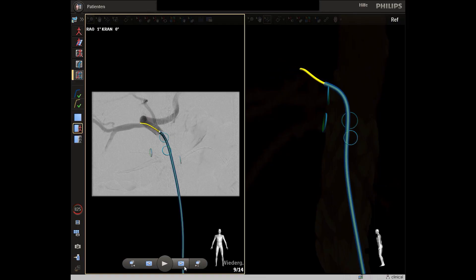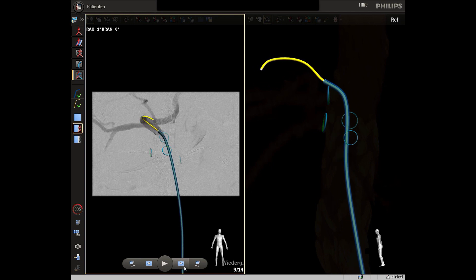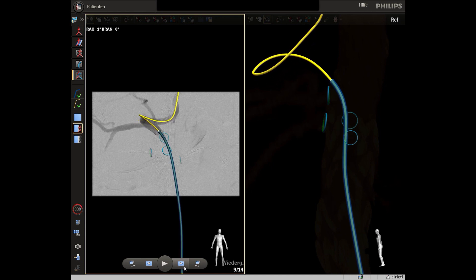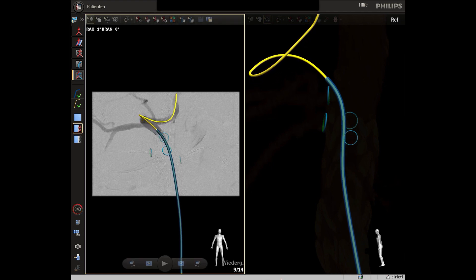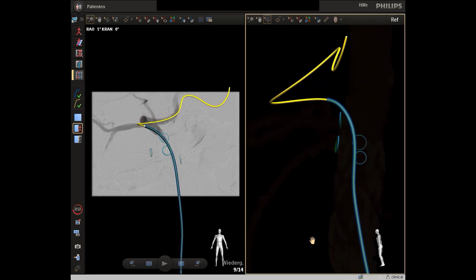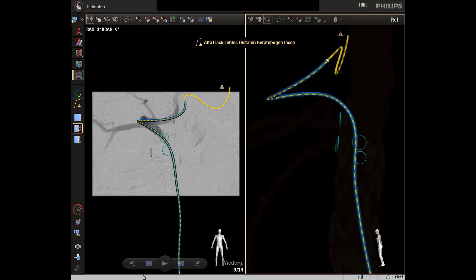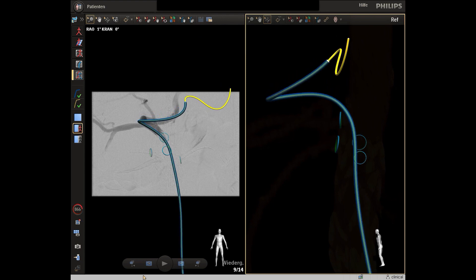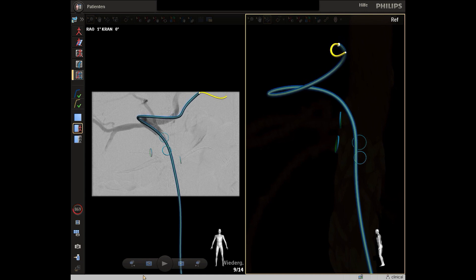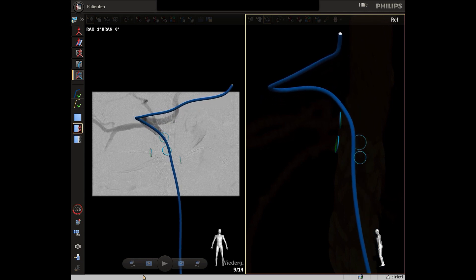This is the celiac artery, which is somewhat upwards pointing, and we again use the Cobra catheter of the FOSS system in combination with the FOSS wire. An angiography is used as an underlying DSA image and the wire is now advanced into the splenic artery. The FOSS catheter is advanced over the wire until it is in position. The slashed line that you see sometimes shows how much pressure is on the FOSS wire and helps us understand how much force we can use in the target vessel. Then the FOSS wire is exchanged for a stiffer Rosen guide wire.